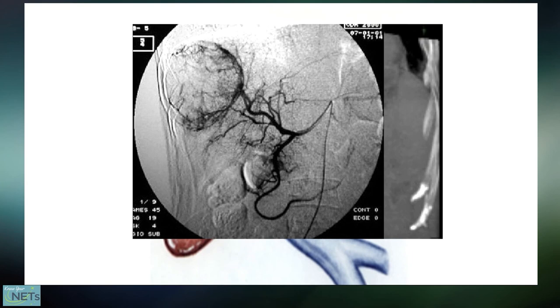And then we bring our patients to the X-ray IR suite, and we do an angiogram where we put a small tube or catheter into the arteries of the liver, and we inject dye, and this is what the angiogram looks like. And as you can see, there's the tumor, the Death Star looking object there, and we need to then navigate a small catheter into the arteries that specifically feed that tumor. And again, the yellow arrow highlights the path that we need to take to get to the tumor.